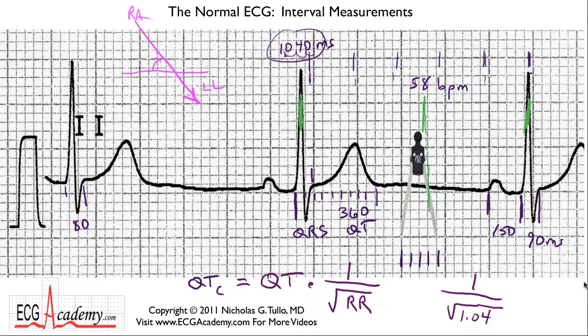Okay. So those are all the intervals that you'd normally measure. Well, I think I'll end this video at this point because it's getting kind of long, but I'm going to add one more video to this section in order to give you some more practice in measuring intervals.